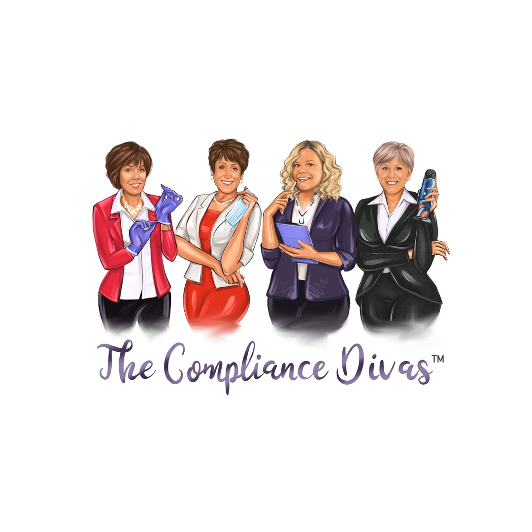So, with all of the different AI tools, it really means following the current practices and methodology, which is critical to case success. So, according to an article on Dr. Bicuspid, the new cone beam CT guidelines don't just impact endodontics, they also ensure that we have up-to-date case-by-case decision making, as you mentioned, that you're tailoring doses specifically for individual patients and needs. And I know that's so important for myself.